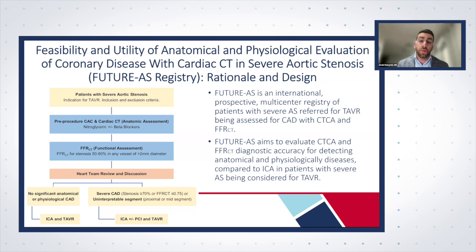Yet for TAVR CT, we don't do that. And that has been due to a historical reluctance or concern that GTN is very dangerous in aortic stenosis. Now, if we go down the rabbit hole, there actually haven't been any studies that have shown any major concern with GTN in aortic stenosis, and that's because there's been an absence of those studies.